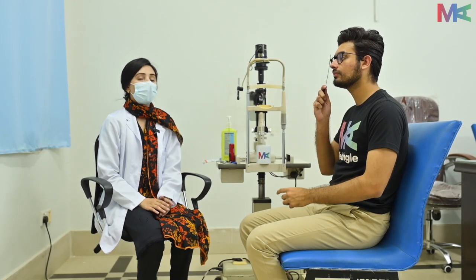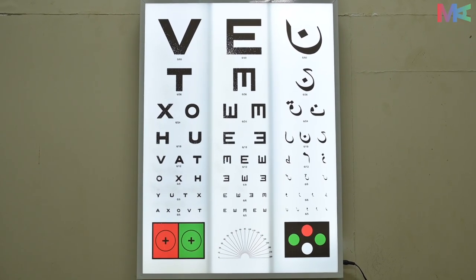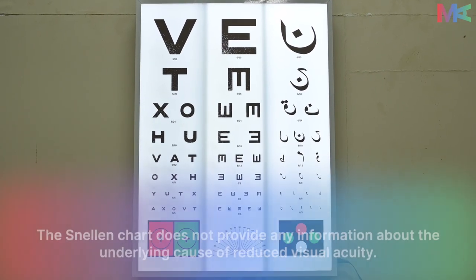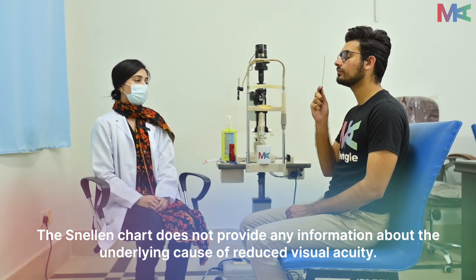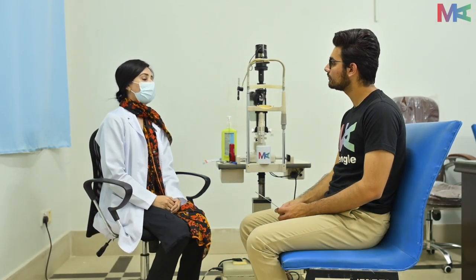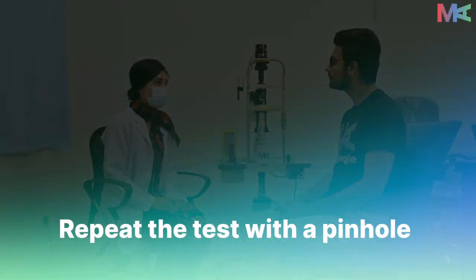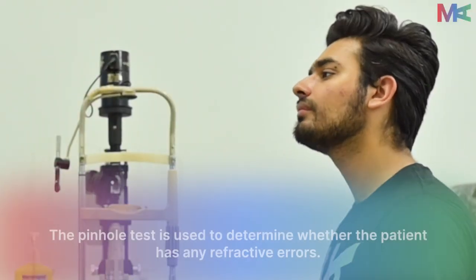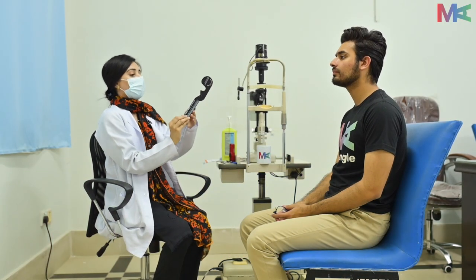And now read the smallest letter possible with your left eye. T-X-O-H-U-V-A.